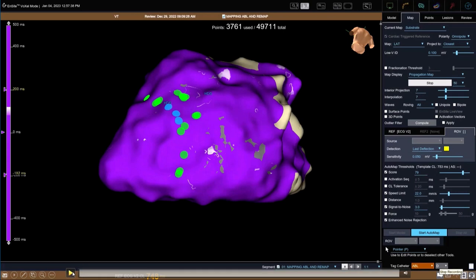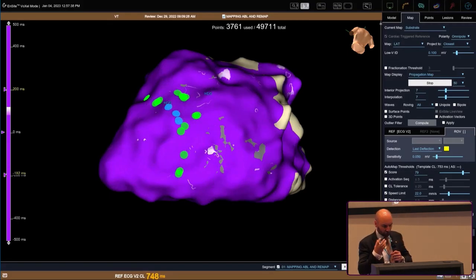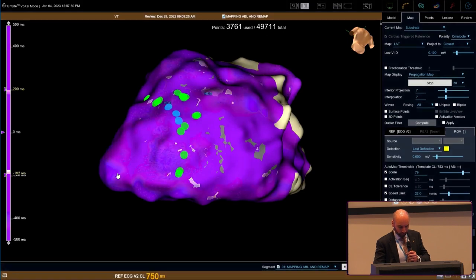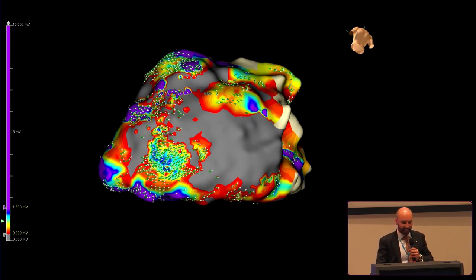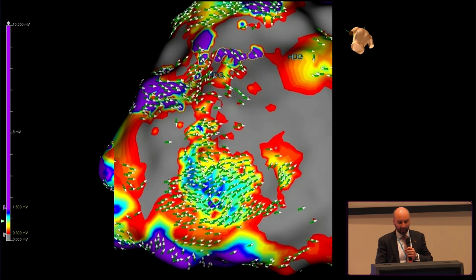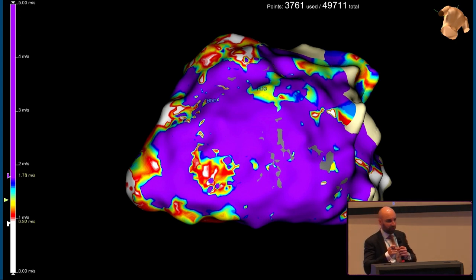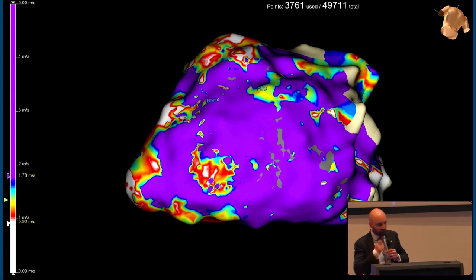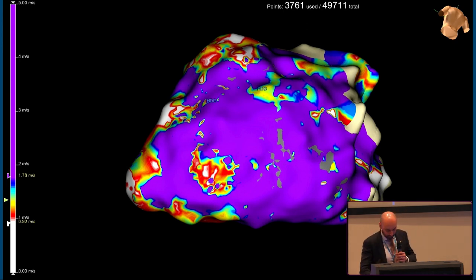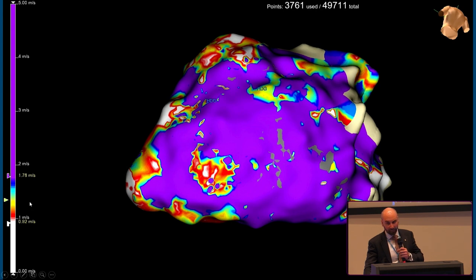With the HD grid and EnSite X, activation direction arrows are very useful to look at activation into the channel. Arrows indicate entry into the dense scar from the top and bottom, with collision somewhere in the middle. The wave speed map shows slow conduction potentially at what could be an exit site. We know that the slowest parts of a VT circuit are the entrance and exit sites—the turnaround points—while the central isthmus actually conducts fairly well.